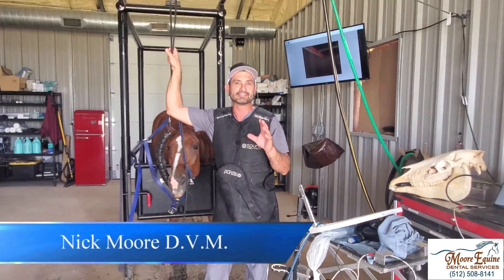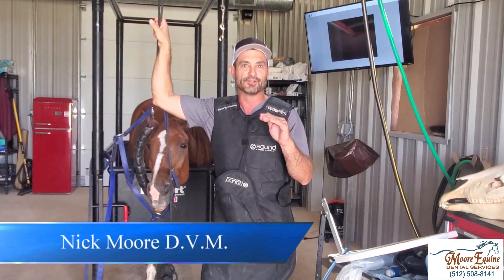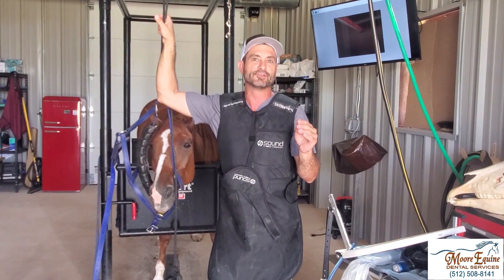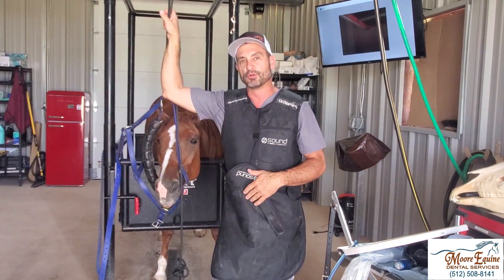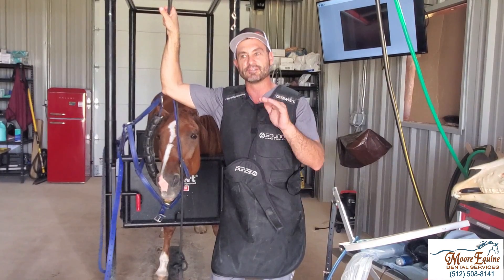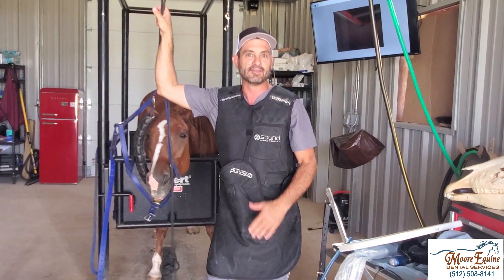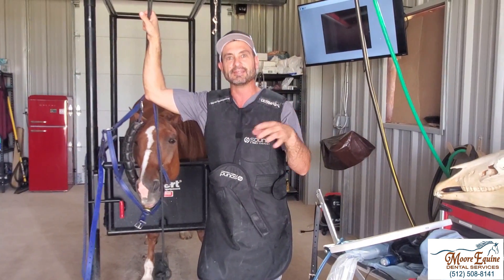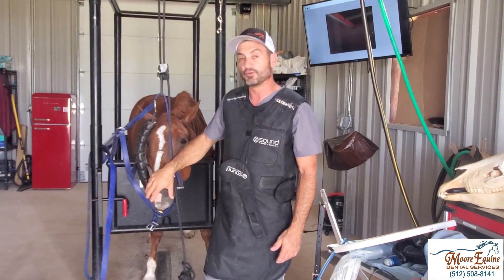What we're going to do here is show you how to take good head x-rays. A lot of veterinarians are really perplexed and intimidated by dental x-rays, so I'm going to show you how to make it really simple. The view we're going to do today — most of the time the most common tooth that has a problem is the upper 9, which is the first molar. We're going to show you a fast way to image the first molar that is going to be diagnostic in most cases. This is your bread and butter technique.